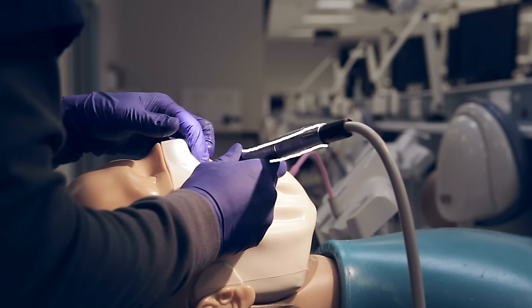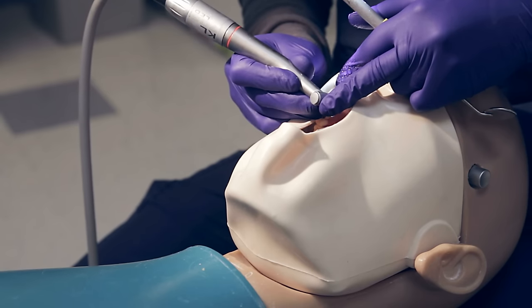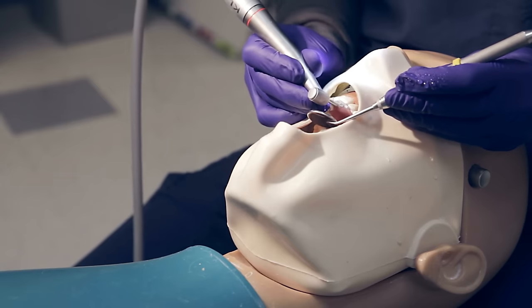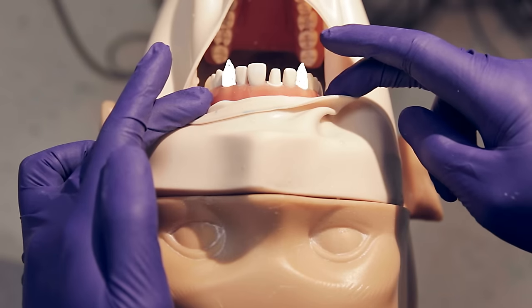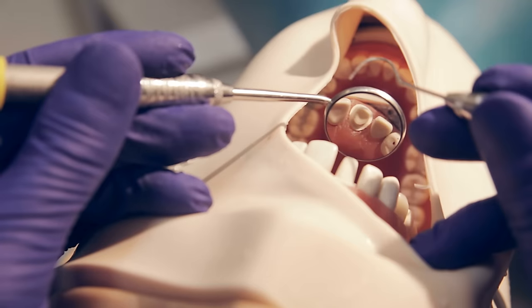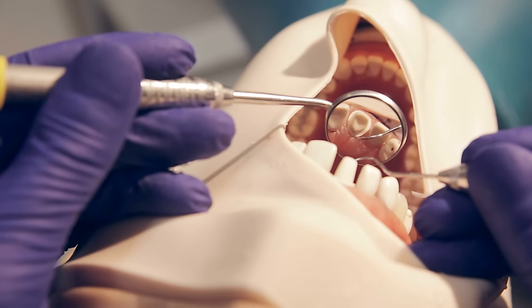Number 8 will be prepped to allow for adequate material thickness. While prepping, it is important to visualize the shape and size of the burrs within the mill. These burrs tend to be larger, so a smooth clean prep will allow for easier milling of the intaglio surface. A well-defined margin and visibility of that margin will allow for an accurate scan and 3D digital reproduction of the prep. If the margin is subgingival or difficult to visualize, cord packing or a laser can be used to reveal the margin.